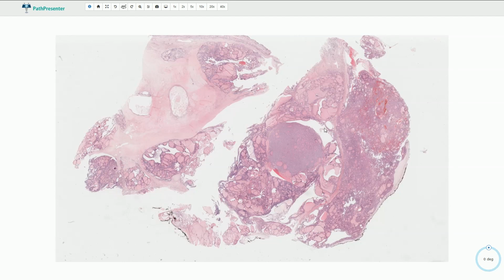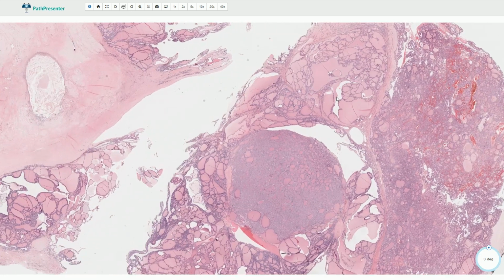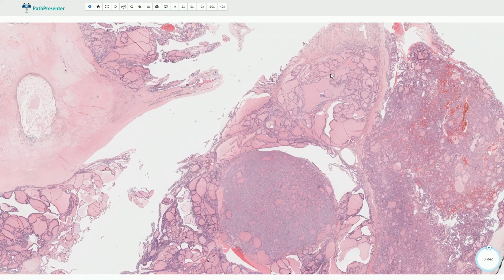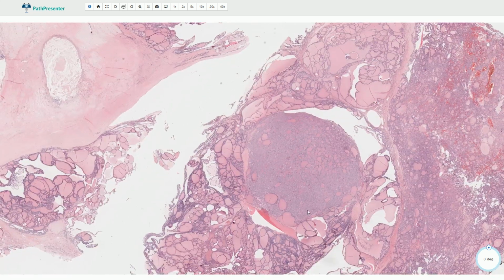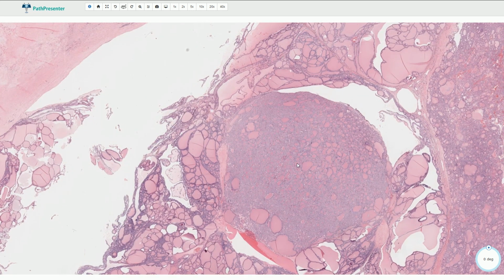Under the microscope, we typically see multiple nodules. Sometimes we can find areas of fibrosis. The follicles are typically not uniform. Some of them are enlarged. Well, we usually do not see these really large follicles in the normal thyroid gland. However, sometimes some nodules can be associated with really small follicles. So here in the center we can see microfollicular adenomatoid nodule.